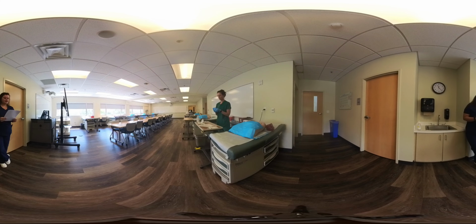Now we're going to clean the site from area of least contaminated, which is the incision or center of wound, to the outside, to the most contaminated, which is the outside of incision, to the surrounding skin.